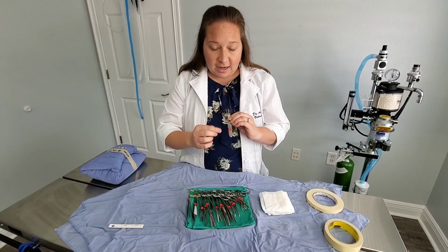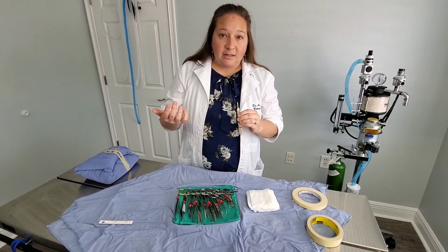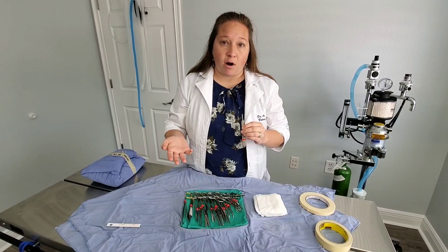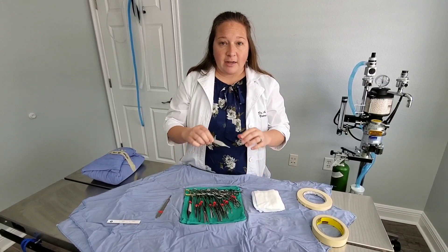This is a blade handle — the scalpel blade slips onto this little piece here. There's a small step, and the blade slips onto that piece. There are different sizes of blades with different tips, and we use those for different kinds of approaches. I would typically use a 10 blade or a 15 blade in a spay or neuter procedure.